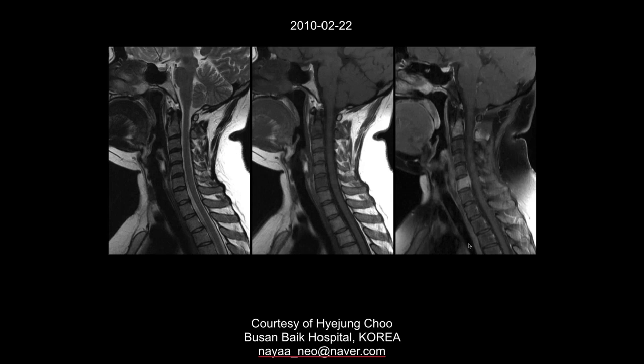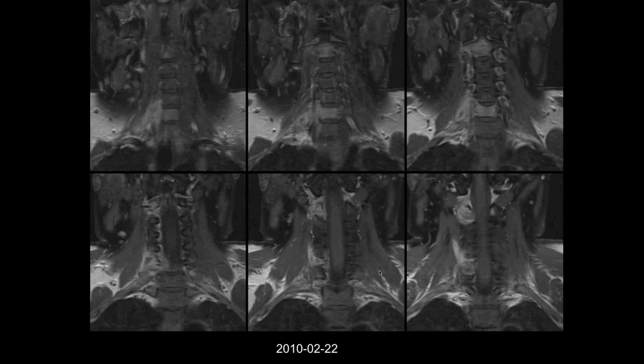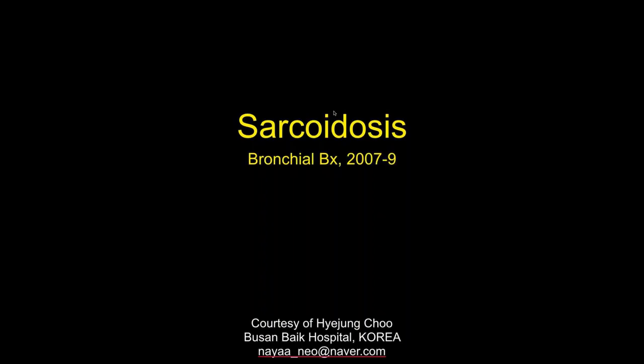A couple of months later we still see edema and enhancement in the vertebral bodies and posterior elements — same appearance. There's a fluid collection, and all this inflammatory tissue is present throughout, involving both the vertebral bodies and posterior elements. This is another case of sarcoidosis.